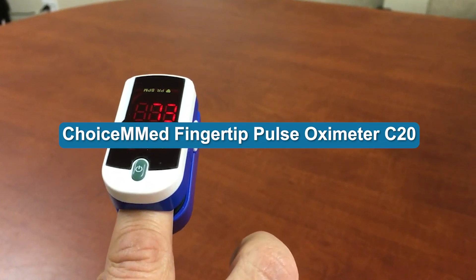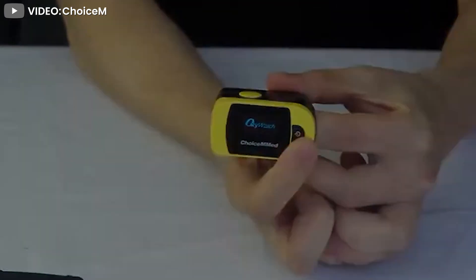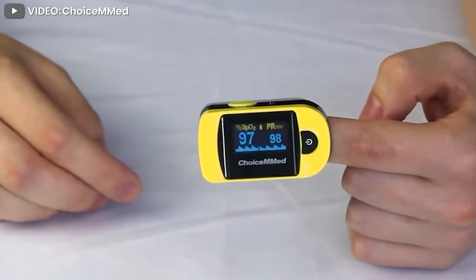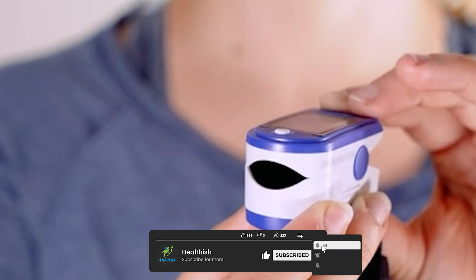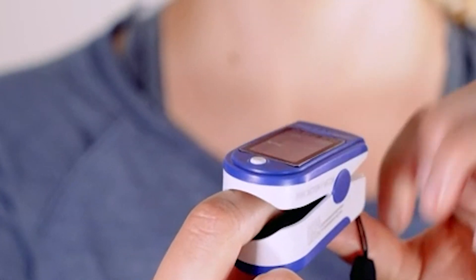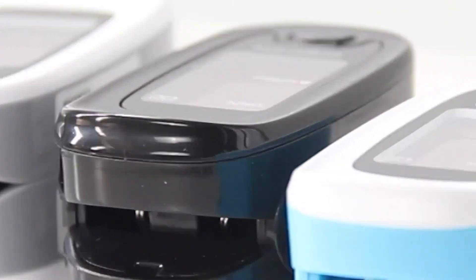The Choice M Med fingertip pulse oximeter is a convenient device used to monitor pulse and blood oxygen levels. The device fits easily on your fingertip and has a clear display for easy reading. The pulse oximeter can be used for both adults and children and has a battery life of up to 30 hours.